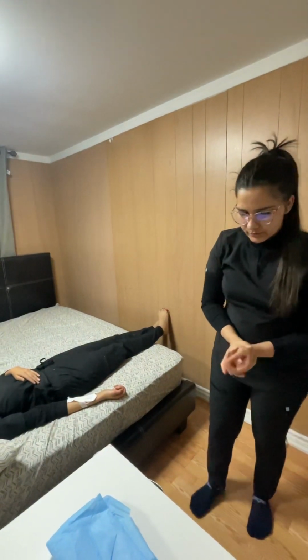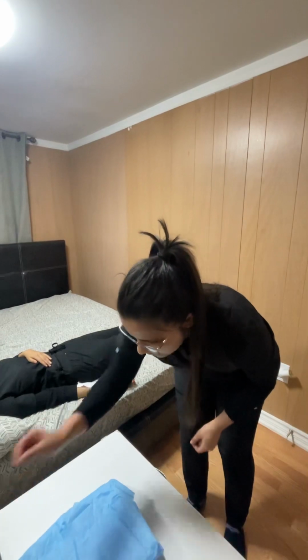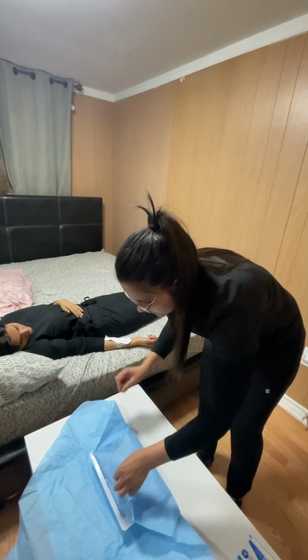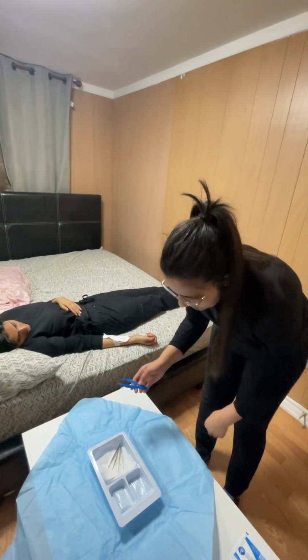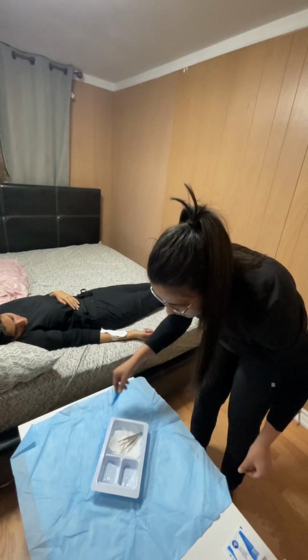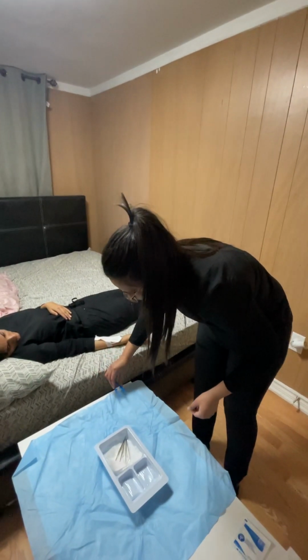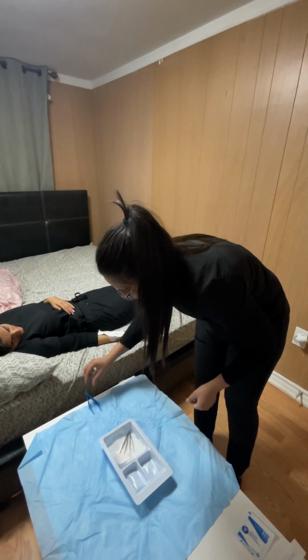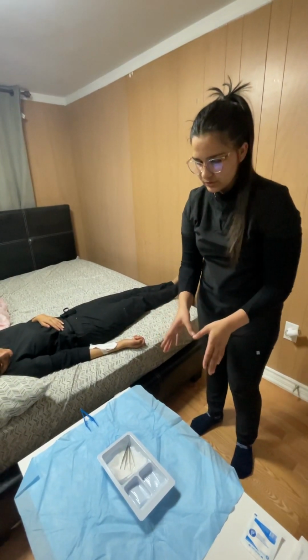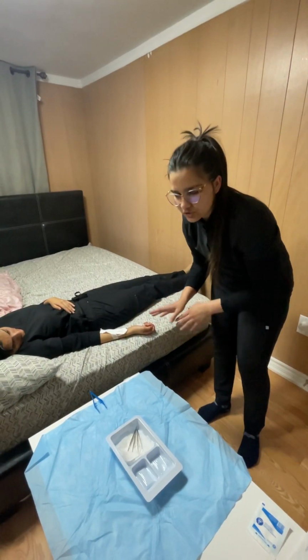After hand hygiene, we are going to open the tray. Firstly, away from me, opening the sides, then towards me. So going to reposition the tray from diamond to square shape and maintaining this 1-inch border. And this is a kind of sterile triangle where this is the dressing area, this is the garbage bin, and this is my patient. We are maintaining the sterile triangle.